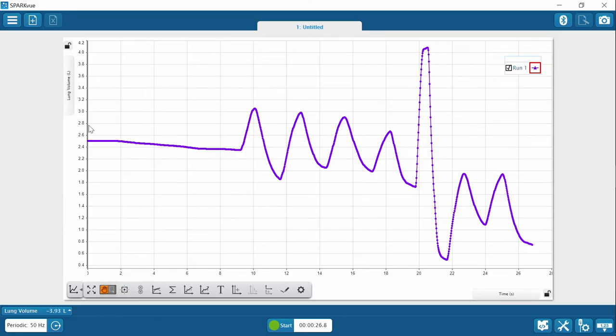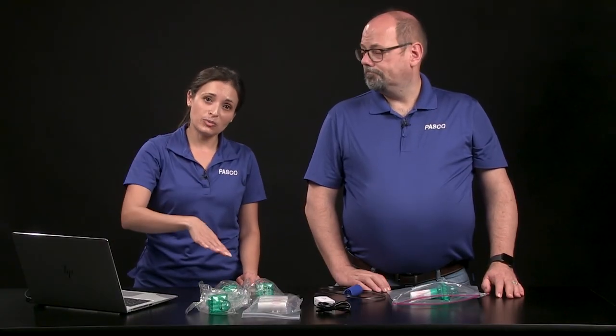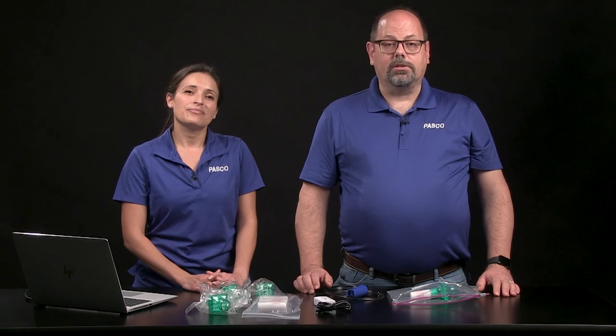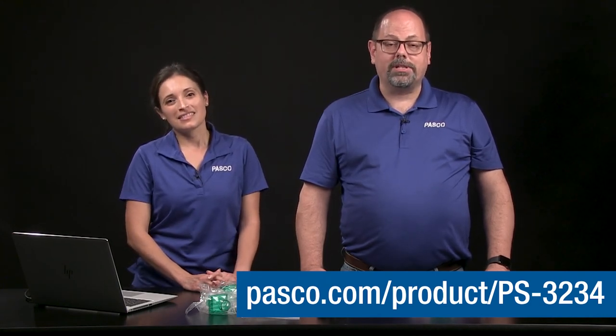This is a lung volume versus time data display, so the upswings represent inhalation and downswings represent exhalation. The coordinates and delta tools will be especially handy for analysis when looking for volumes and capacities such as tidal volume, or the forced vital capacity and forced expiratory volume in one second, which are important for assessing lung function in clinical settings. You can check out the investigation titled Spirometry Pulmonary Function in PASCO's experiment library to learn how to interpret each region of a spirometry test and other ways to display spirometry data.